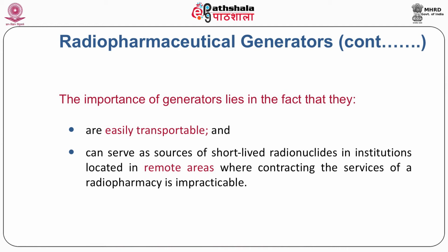This is one production method by which technetium is produced, a very important way, and it is used in most nuclear medicine departments in our country.